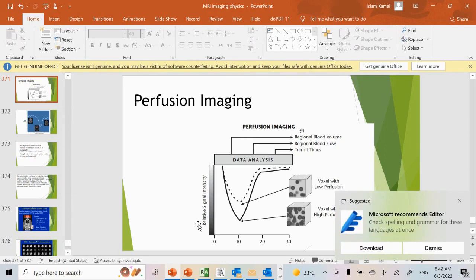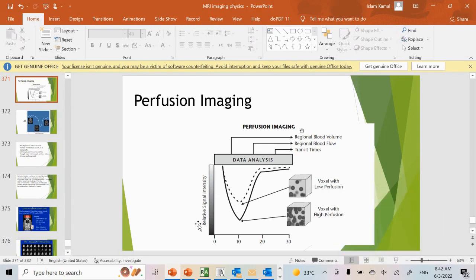As a result, the tumor demands a significantly higher blood supply compared to the surrounding normal tissue. This increased perfusion can be detected when analyzing the tumor, as it shows a distinct difference in blood flow compared to the surrounding tissue. The area of the tumor therefore exhibits a higher perfusion rate than the rest of the surrounding tissue, indicating its unique vascular needs.